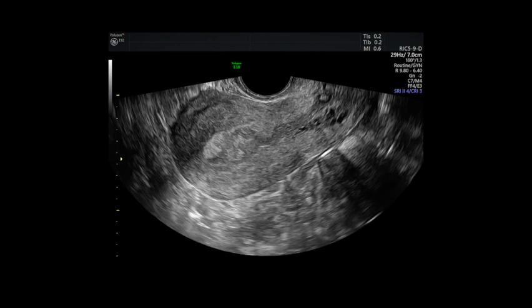The previous slides demonstrate that endometrial thickness is not the most reliable assessment in premenopausal women. If concern for hyperplasia or cancer exists in these women, consultation with an OBGYN or possible EMB or hysteroscopy may be indicated. However, the clinical picture does get a little bit clearer and the utility of ultrasound gets more apparent when considering symptomatic postmenopausal women.